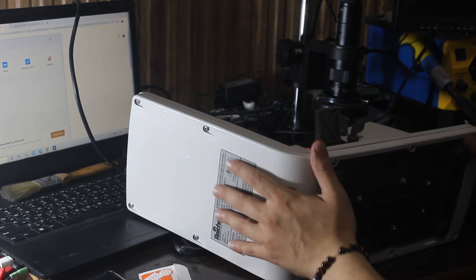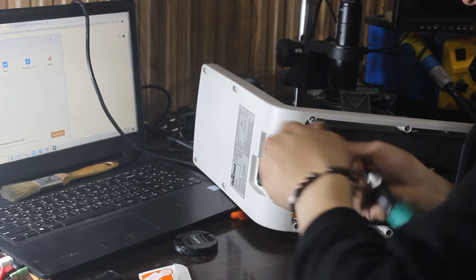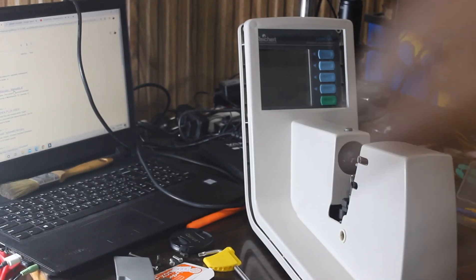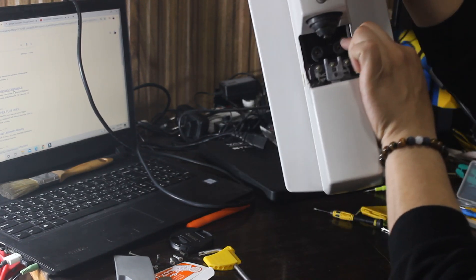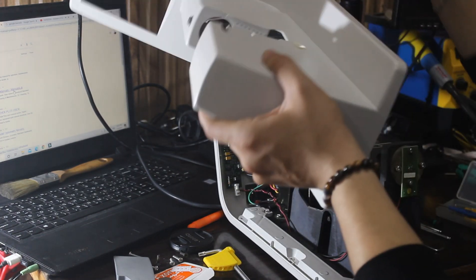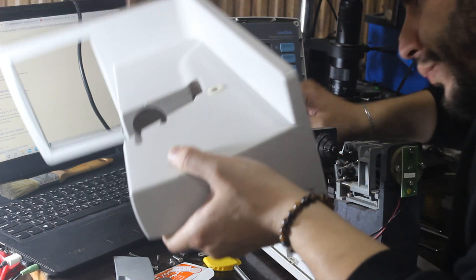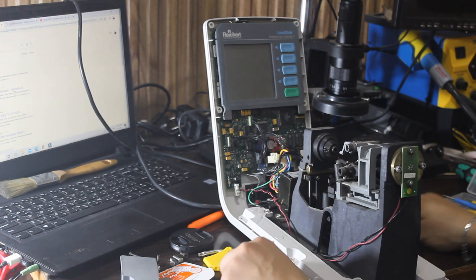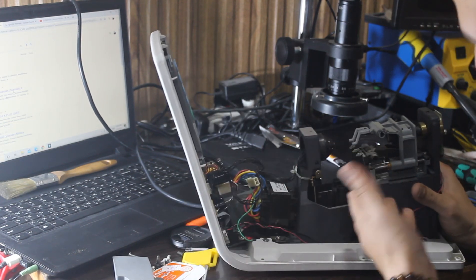We need to open it. Just pull this one down — pull it down and the cover will come off. We need to pay attention to this switch; we need to remove this switch. Now we are fine to check. It's so dirty, a lot of dust.